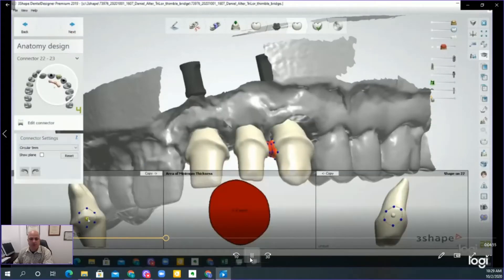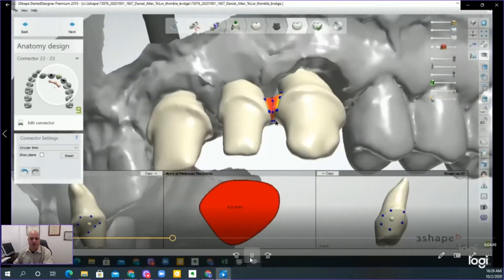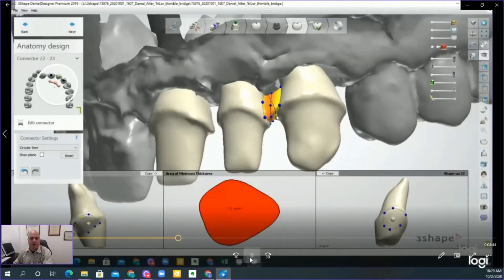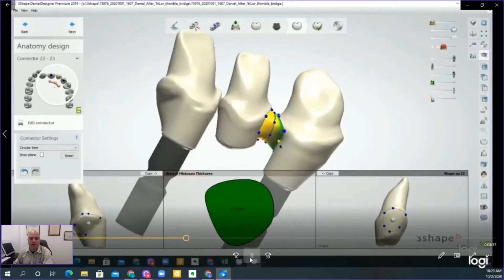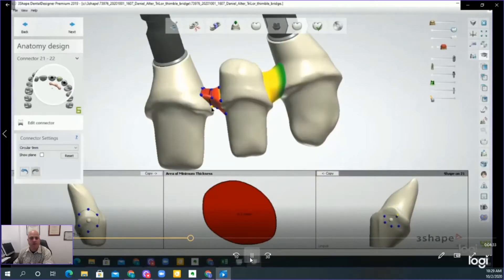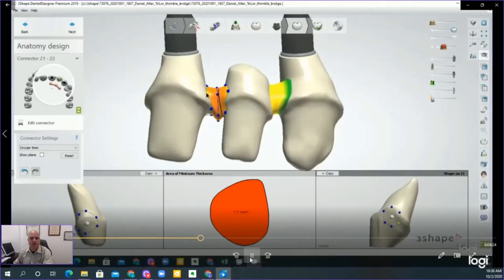Unlike other thimble bridges where you can't necessarily adjust the preparation, here we've set it up so that you can adjust. When setting up the connectors for the bridge, you want to do everything sub-gingival assuming you have the space, and you want to create at least a nine-millimeter-squared type of connection. Within the DME that comes with the library, you have it validated for the material, which turns green once you reach nine millimeters — the strength that you need.